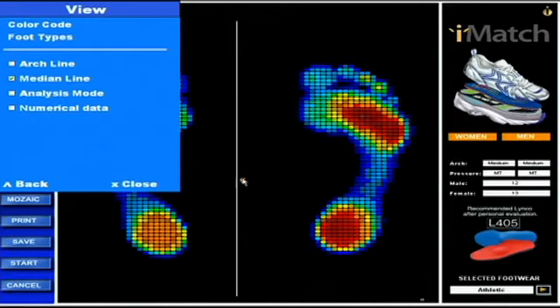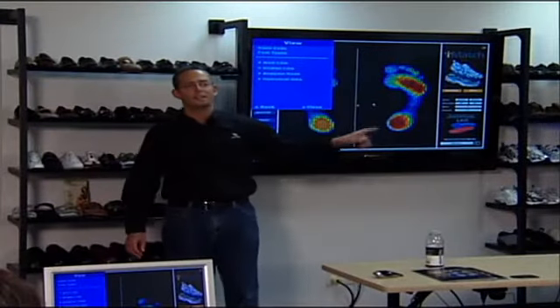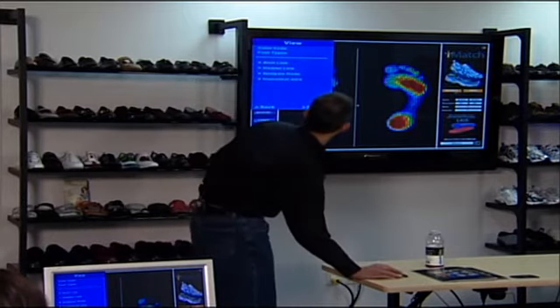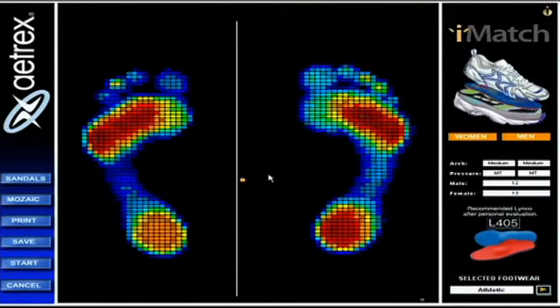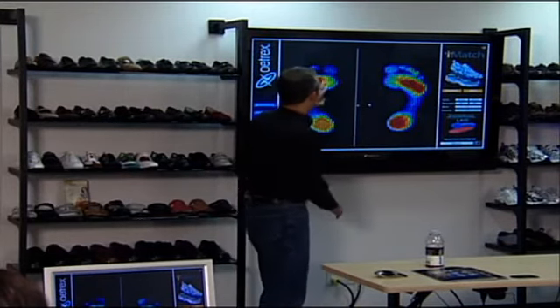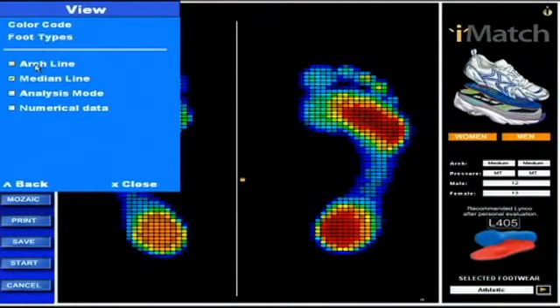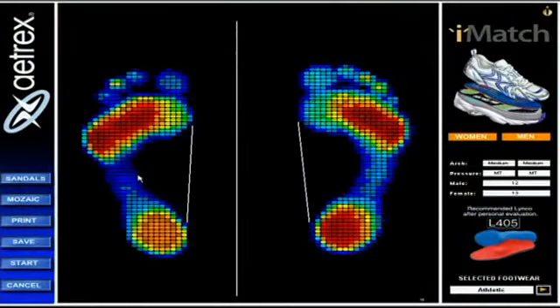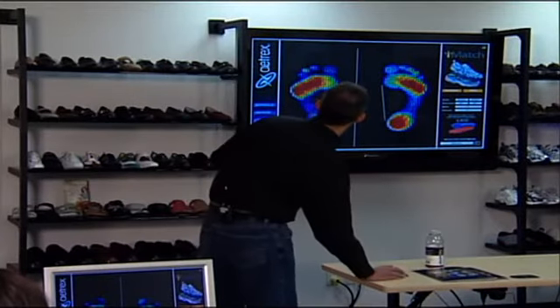We already covered the median line. You can see the center of gravity — this little X in the middle of the test — is exactly where the midpoint is in terms of pressure. This was actually Glenn's test, and you can see Glenn was standing a little bit more to the right. The arch line, back in View, connects the ball of the foot to the heel. We'll bring this up later to show how the machine determines whether this is a low, medium, or high arch foot.